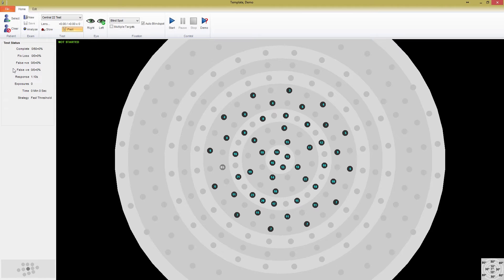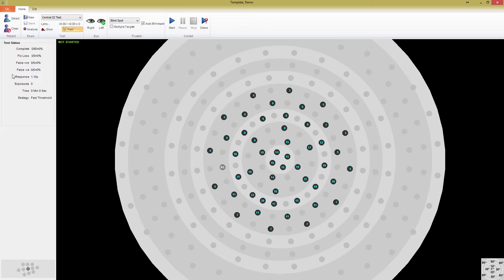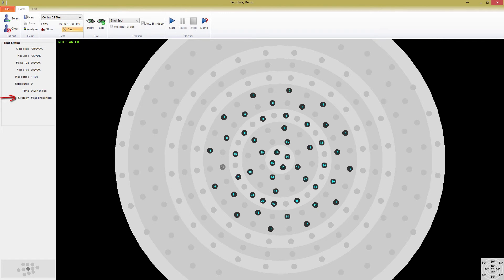On the other hand, false negatives occur when a patient fails to respond to a bright exposure in a point where the threshold is already known. This may be an indicator of patient fatigue, or that they're just not paying attention anymore. The response monitor is based on the response time that is set for the test. If you've selected adaptive response, this may change throughout the test, as Medmont Studio adapts to your patient's speed. The exposures monitor shows the total number of exposures that have been shown to the patient, and the time monitor gives an indication of how much time has elapsed since the test began. The strategy listed at the bottom will not change as the test progresses, and it shows which testing strategy the test is using.